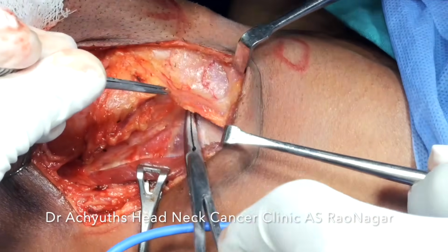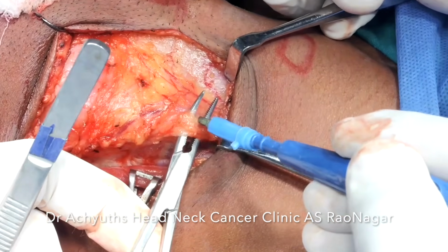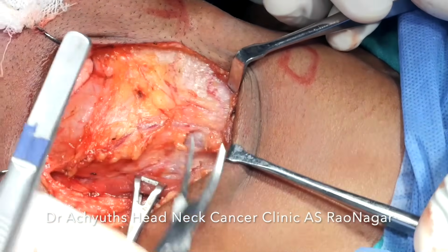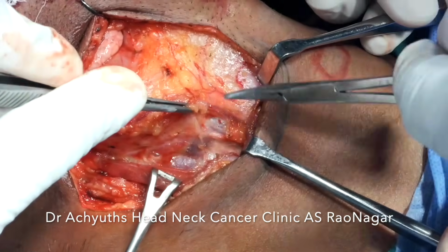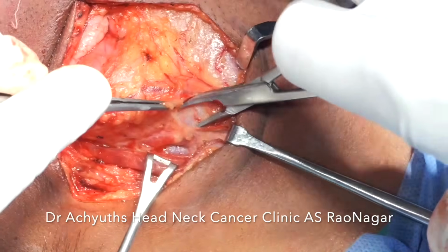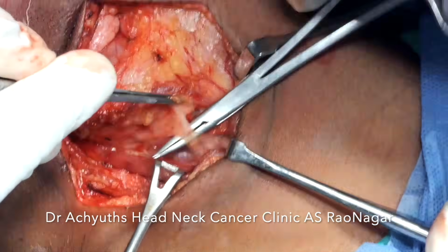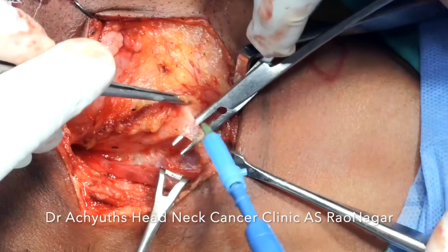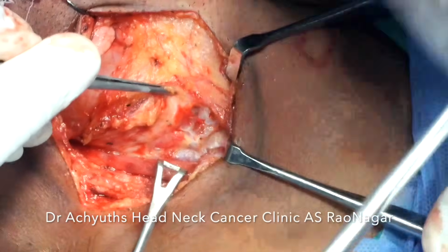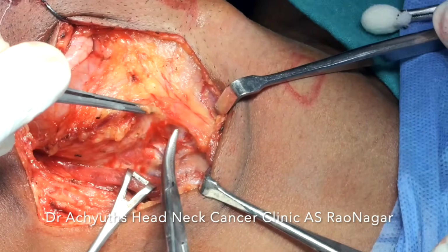Whenever we are doing this step, we should understand that we are in the proximity of identifying the internal jugular vein. Now here, through the fascial attachments, you can very much see the underlying venous system when we are operating without damaging the venous supply.